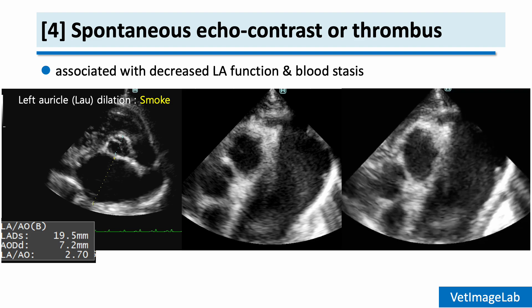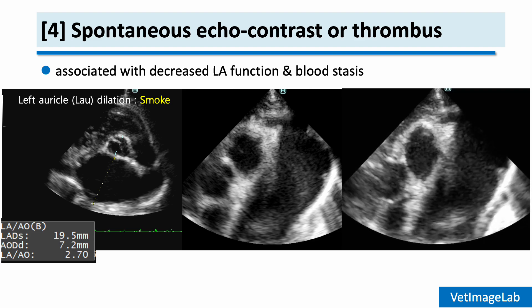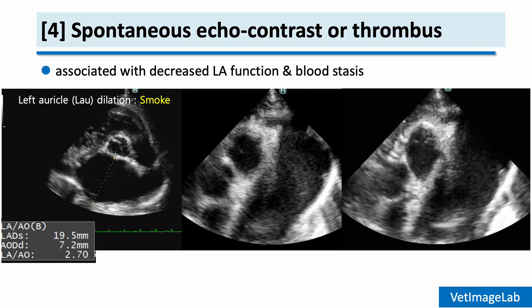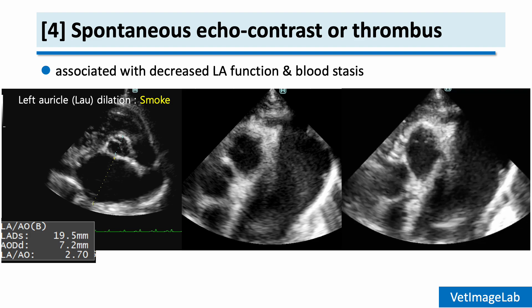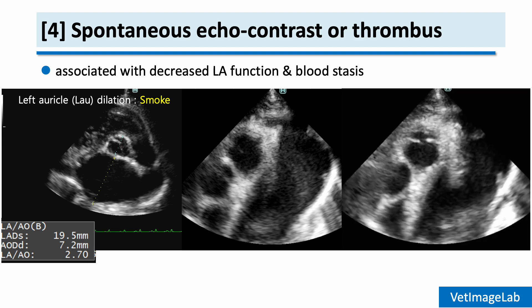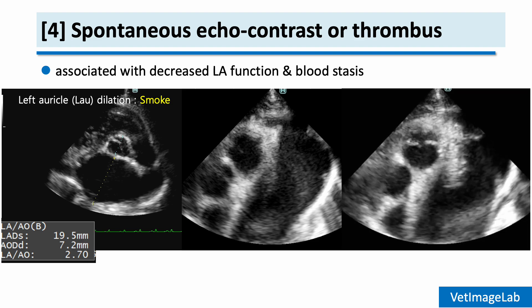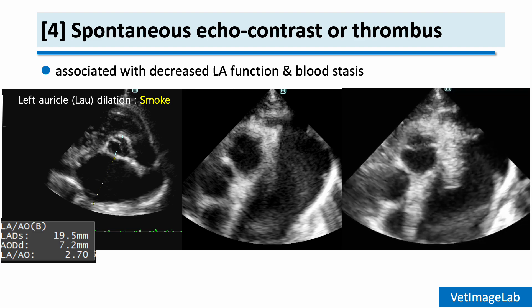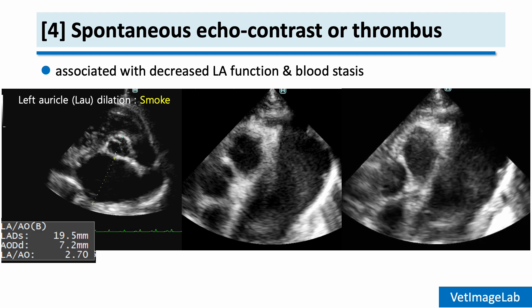When the left atrium and auricle become markedly enlarged, the risk of blood stasis increases. In these situations, we may observe spontaneous echocontrast, often referred to as smoke, on echocardiography. You can see in these images the swirling, smoke-like appearance within the left atrial cavity and auricle. This appearance reflects very slow, stagnant blood flow, which is strongly associated with an increased risk for thrombus formation.